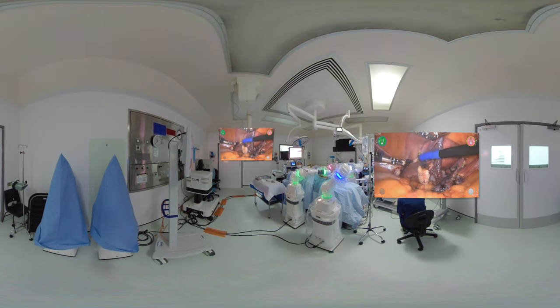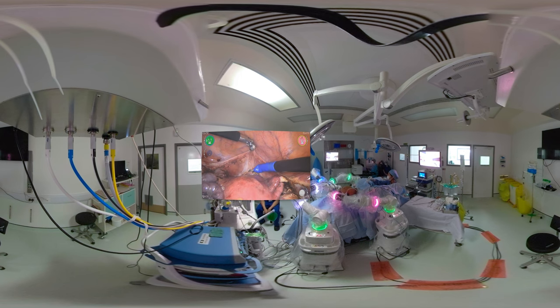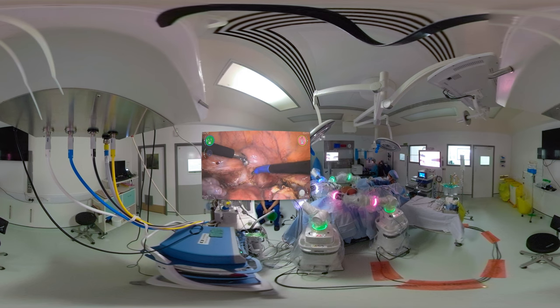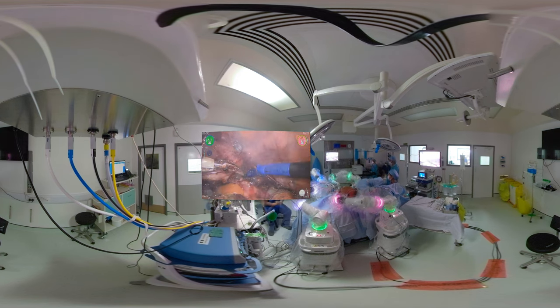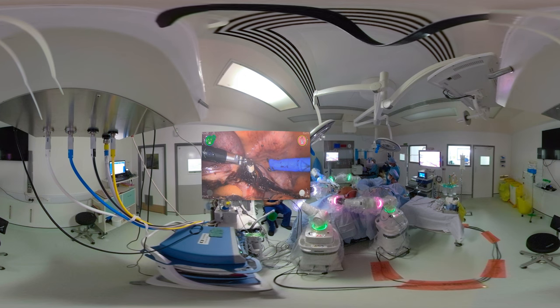We're going to go right by the side of the uterus now, and again dissect the posterior fold of the broad ligament further so we can isolate and skeletonize the uterine vessels. This is the front of the uterovesical pouch — this patient has had a cesarean section but we have successfully managed to separate that and carefully dissected and pushed the bladder down. It's a nice clear plane there for us to be able to do our next step, which is the colpotomy and cutting around the cervix. We're going to start cutting around the rim of our V-Care, which is green in colour, and we should soon see that green come into view.